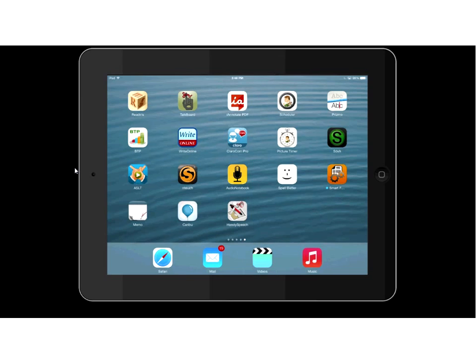And today in our app review, we're going to talk about a communication app that I really like, actually. It's called Clarocom US Pro. You got to make sure you're getting the US version. This is a company that originated out of Great Britain, so there's a British version as well. But if you get the US version, this is $14. It's a very, very affordable app. So let's go ahead and open it up and take a look at what it does.